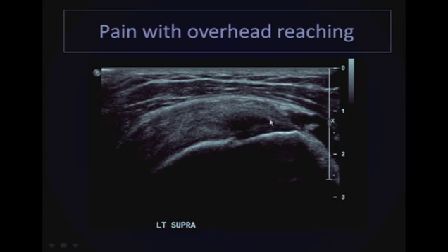Is this anisotropy? So first, you would reorient the transducer, make sure to see. But second, you can already see that where we have the tendon at 90 degrees to the sound, we do not have those parallel lines. So this is a patient with tendinosis, and this is part of the tendinosis, and is not anisotropy.